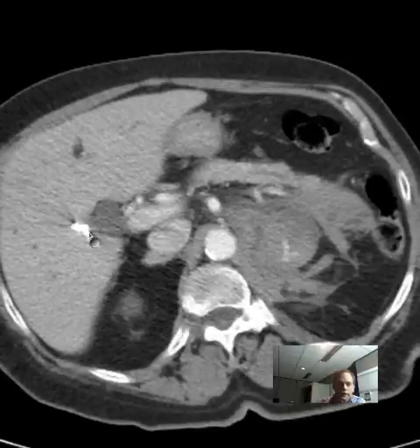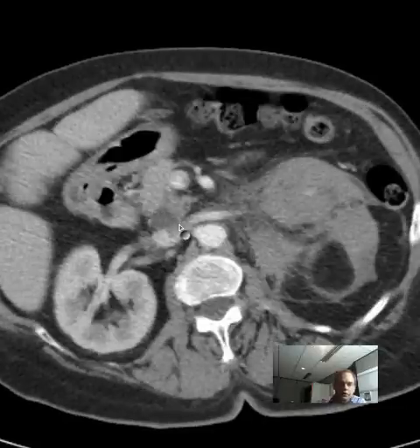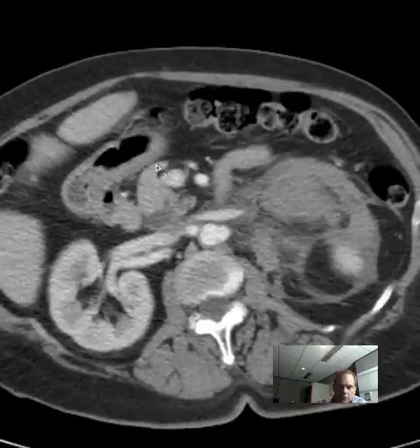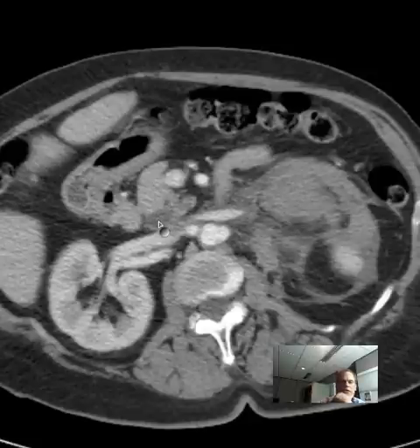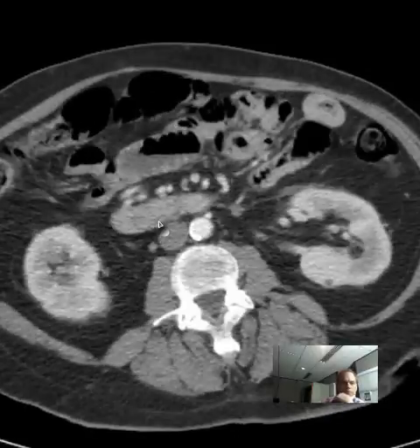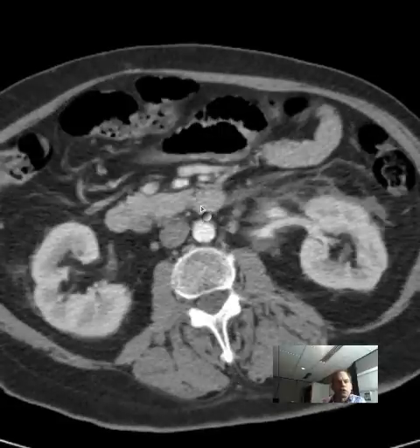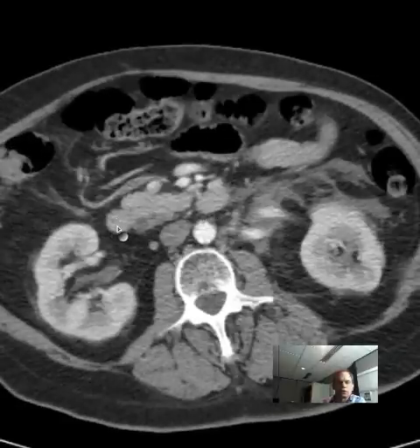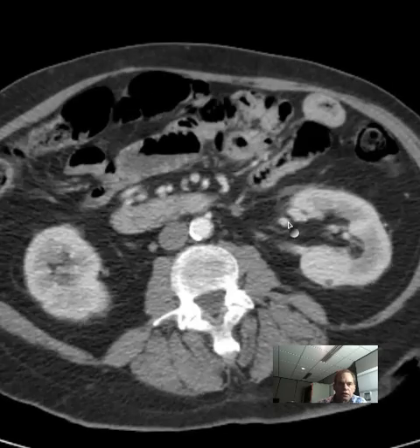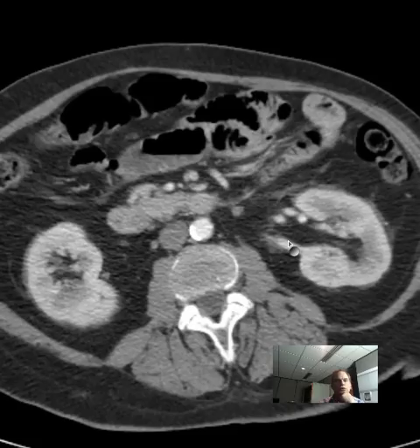A patient had the gallbladder out, and here you can see the common bile duct going toward the pancreas through the head of the pancreas, which is not real well demonstrated here, but this is the head of the pancreas here, and the distal common bile duct should be emptying out into the duodenum, which is right here. And if you go farther, you see the transverse or third portion of the duodenum. You go up back again, and here you have the second portion of the duodenum, which is the vertically oriented portion. And if you look at this common bile duct and watch closely, it just kind of disappears right at this level as it merges with the second portion of the duodenum.